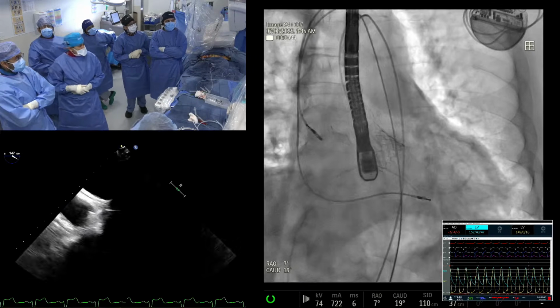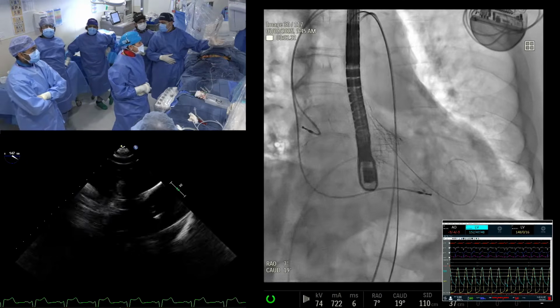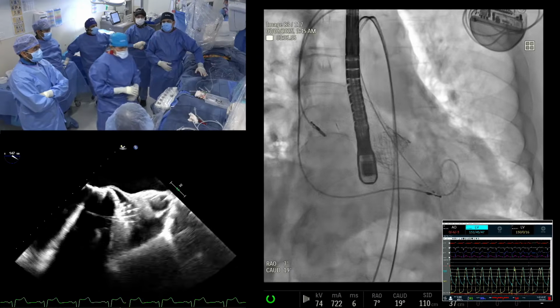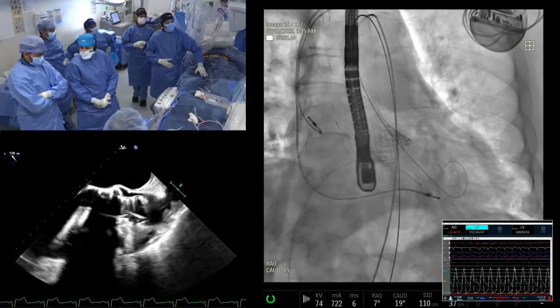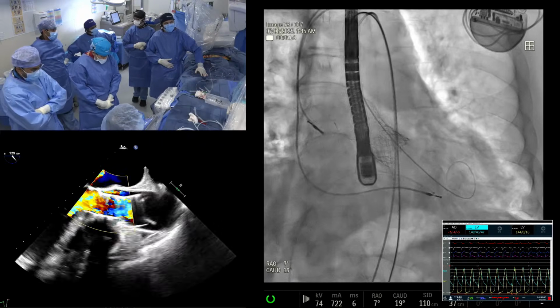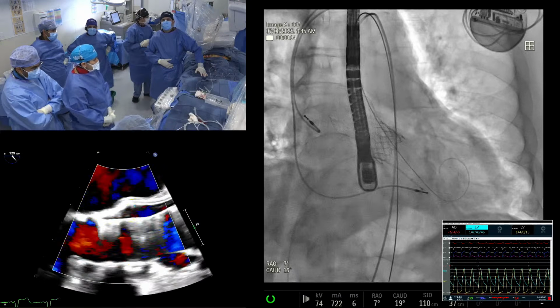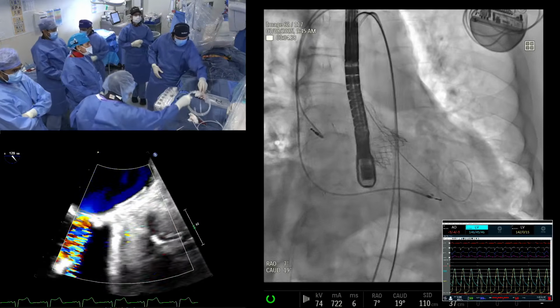I don't think it looks that bad on the AR index, right? The diastolic pressures are actually better than your starting diastolic pressure. End diastolic pressure is 18, and the aortic diastolic pressure is 60. So it's better than before? Yes. Okay, Prof. Stan, what is your quantification then? I told you, mild. Mild, all right. Take it.